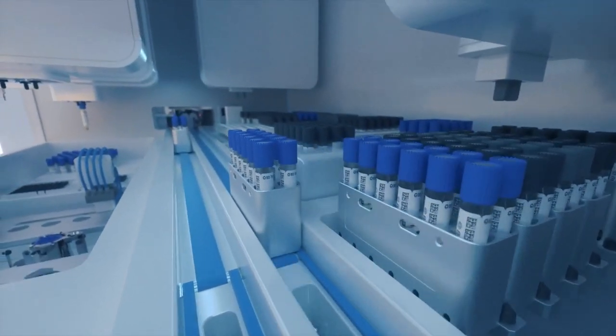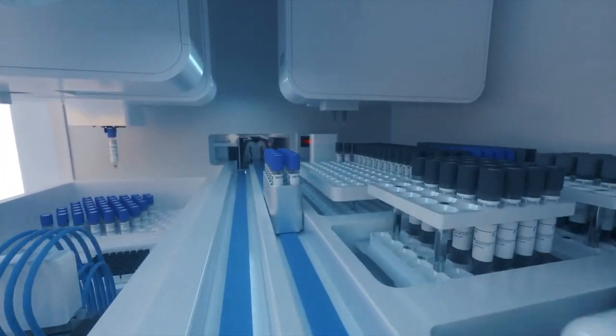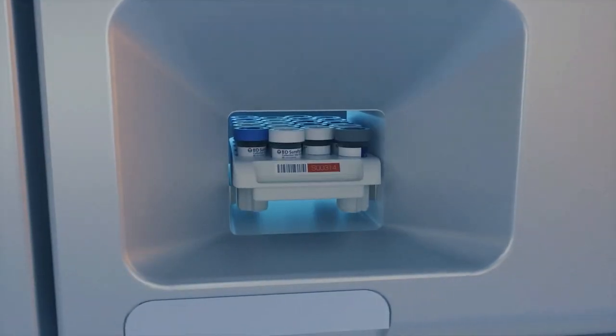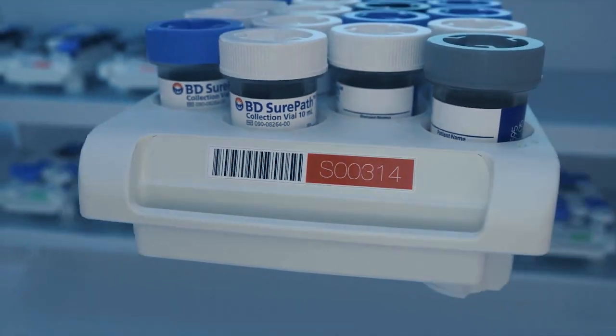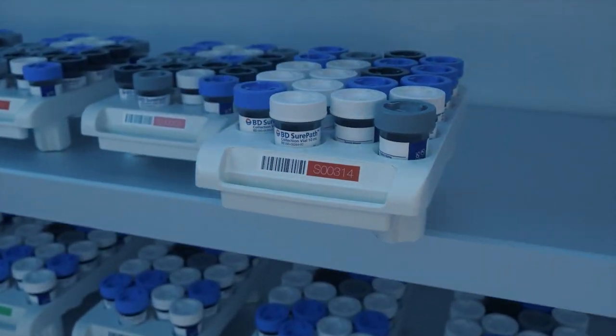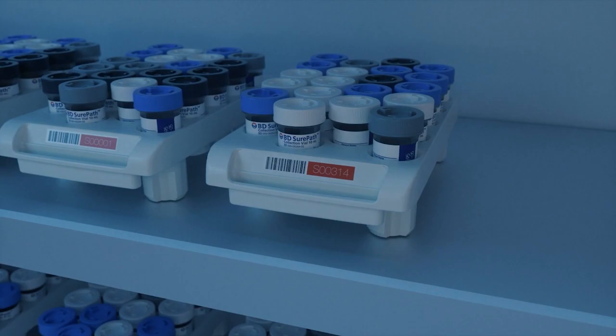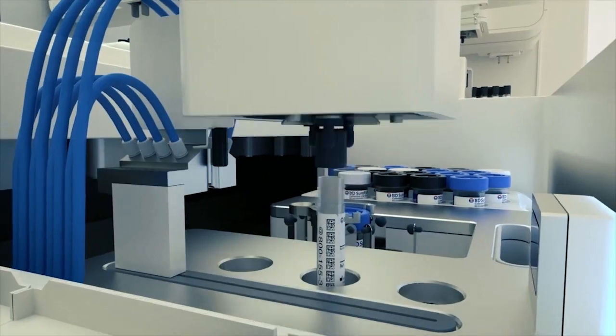After testing, the sample racks can go right into storage. Barcoding makes specimen management and retrieval easy and less time consuming.